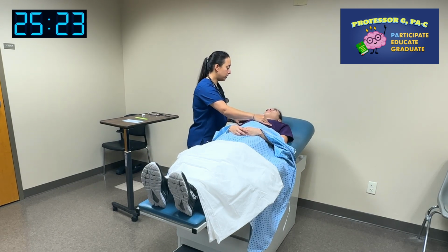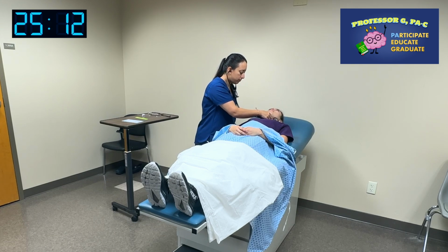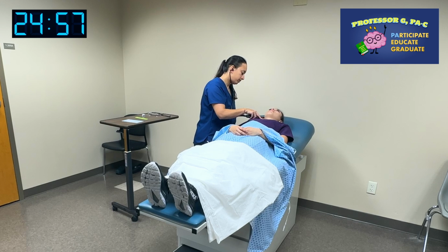Okay. Next up, I'm going to listen to your chest in those same spots, okay? But first, I'm going to listen to your neck, the carotids. Okay, so I'm going to switch over to my bell. Good. All right, I'm going to listen to your chest. You can just breathe normally. Okay, I'm going to borrow your wrist.